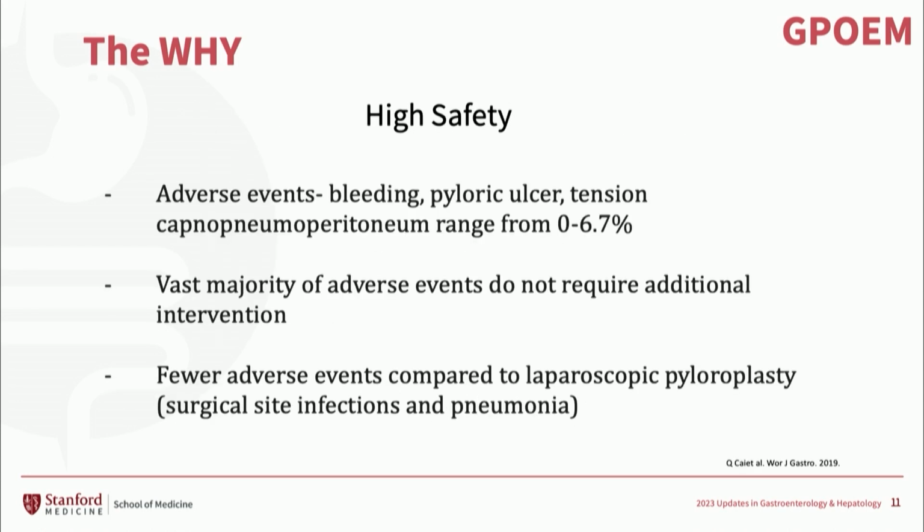And when going into the safety, similar to POEM, it's an overall very safe procedure. There are a few serious adverse events and even fewer adverse events that might require intervention. And generally speaking, if they do, that would be primarily an endoscopic intervention, rarely surgical.